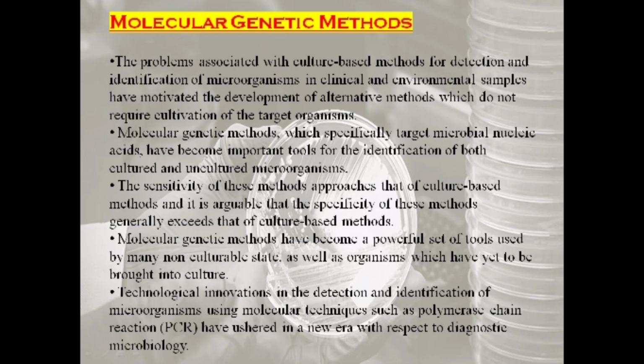Molecular genetic methods. The problems associated with culture-based methods for detection and identification of microorganisms in clinical and environmental samples have motivated the development of alternative methods which do not require cultivation of the target organisms. Molecular genetic methods, which specifically target microbial nucleic acids, have become an important tool for the identification of both cultured and uncultured microorganisms. They have become a powerful set of tools used for many non-culturable strains as well as organisms which have yet to be brought into culture.